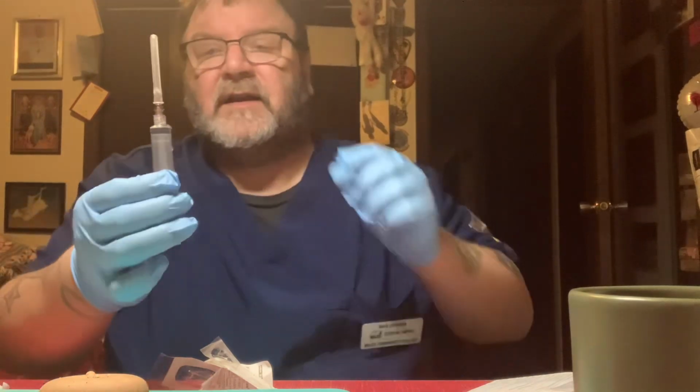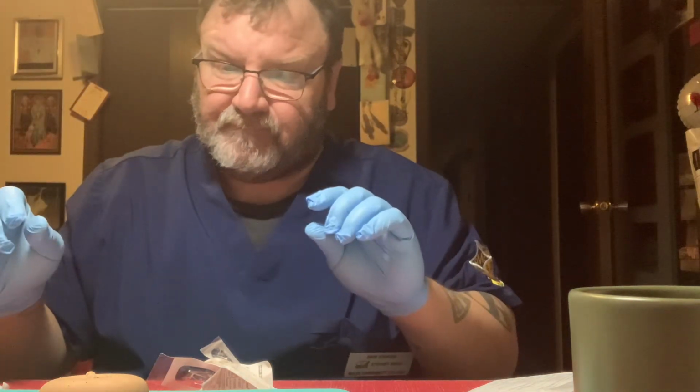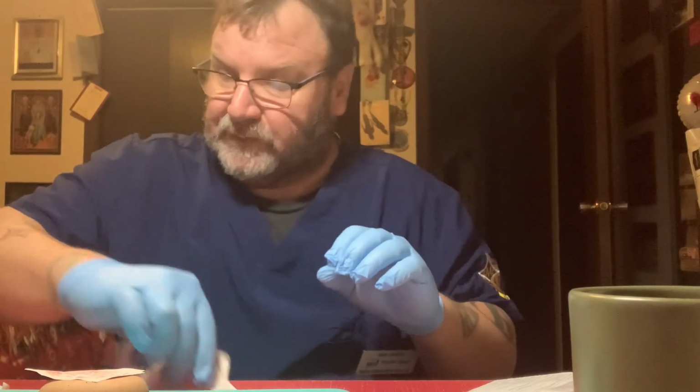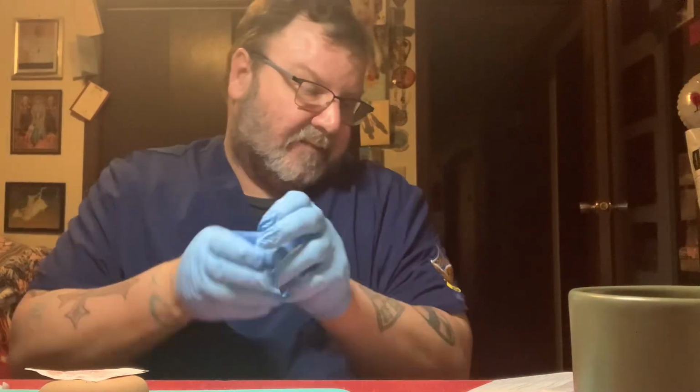And I will one-hand scoop for safety, grasping low. This goes into sharps. I would take a gauze or bandage over the patient's area if I need, not pressing, but if I needed to clean it. I would dispose of my trash appropriately in sharps or the waste bin. I would do some hand hygiene. Take my gloves off. Get rid of that. Hand hygiene.